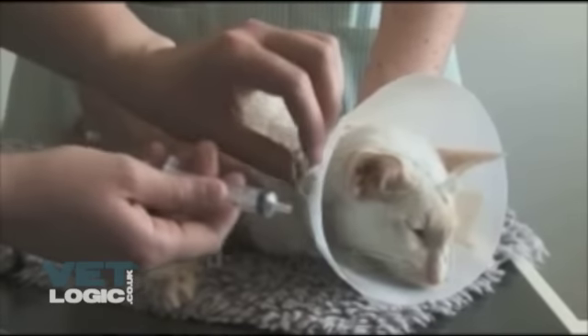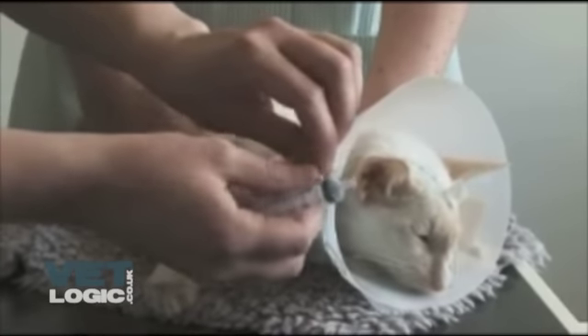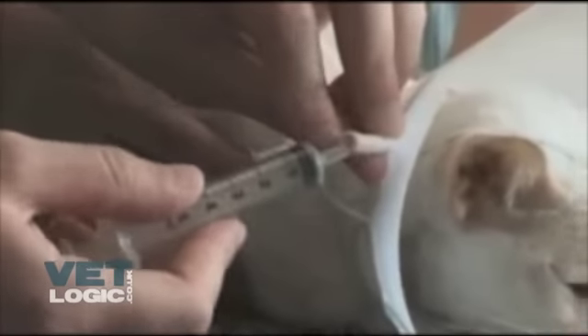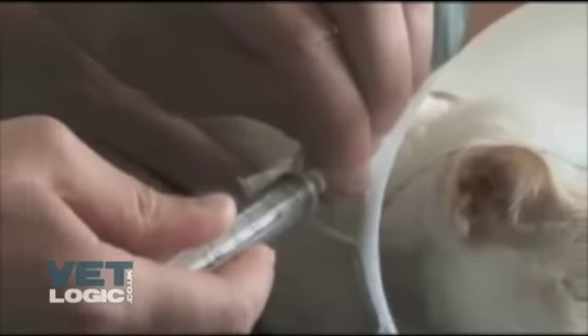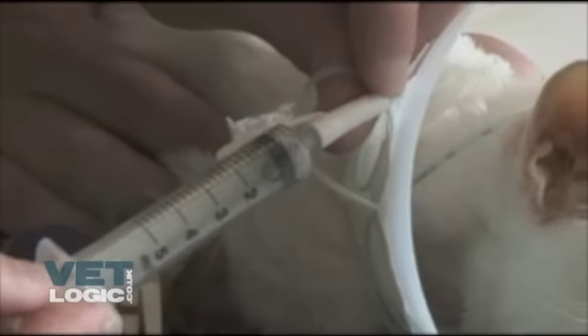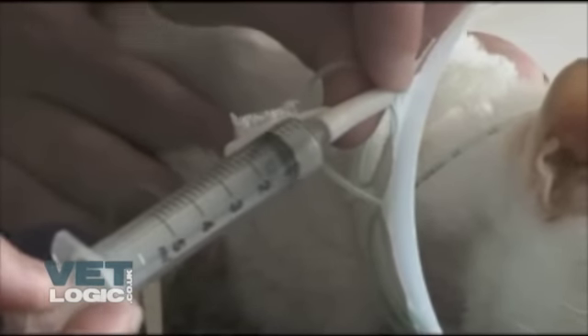The tube should be checked to ensure it has not been guided into the trachea by attaching a 5ml syringe onto the end of the tube and drawing back. If the tube is in the esophagus, a vacuum should be felt in the syringe due to the esophagus collapsing down on the tube. If the tube has been misplaced into the trachea, then air will be easily aspirated and so the tube should be withdrawn and then placed again.